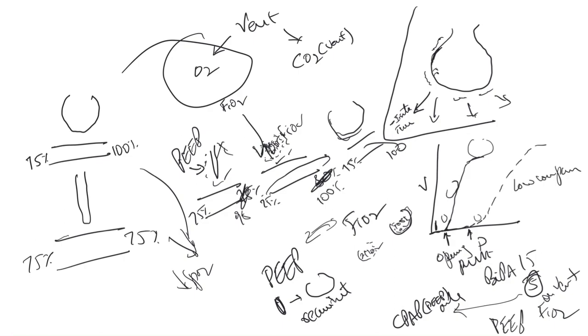You have to figure out why your patient is hypoxic. If you have an X-ray that is very abnormal, like wide consolidations, those are de-recruited. So this is what you're dealing with. And there will be partially open alveoli that are smaller. You'll be dealing with FiO2. So for every patient, of course, give FiO2. But you have to give positive pressure, that is PEEP, so that you recruit these collapsed alveoli.